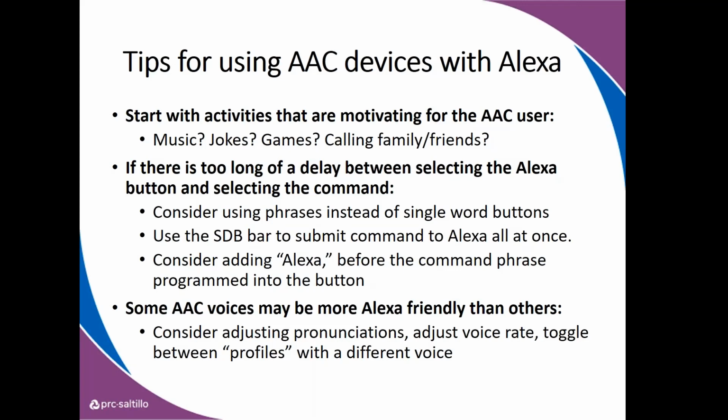And sometimes with your phrases, another thing, maybe just putting a comma to slow it down if she's not understanding or you're saying something too fast can be helpful. Being mindful of time here too, we're doing great.